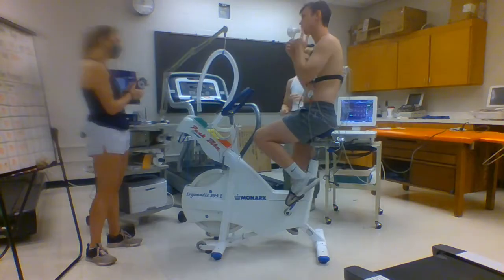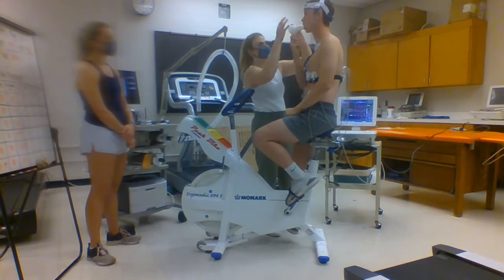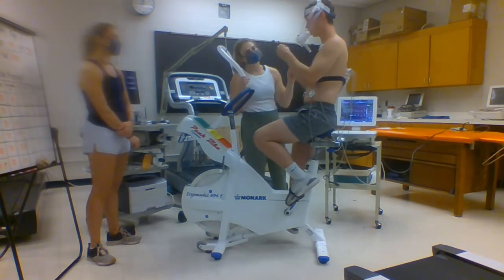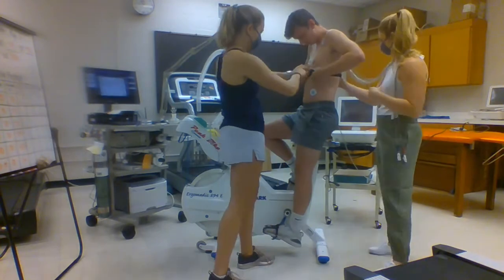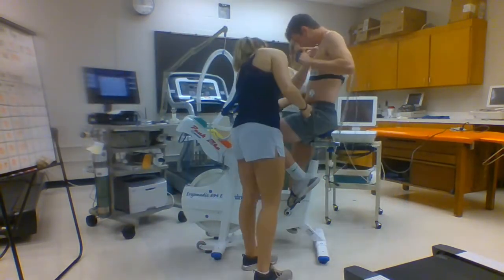We will be using a cycle ergometer protocol that increases resistance while pedal cadence stays constant. First, the participant is hooked up to the metabolic cart where he or she is breathing through a one-way valve that will allow for the measurement of oxygen consumption and carbon dioxide production throughout the test. Second, the ECG machine will measure the electrical activity of the heart.